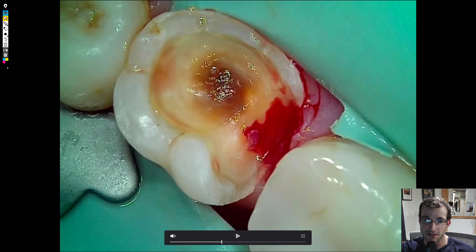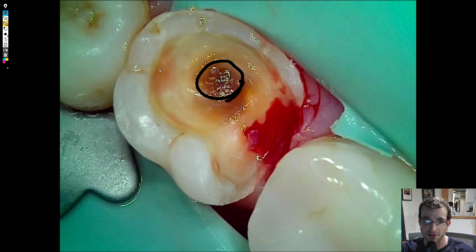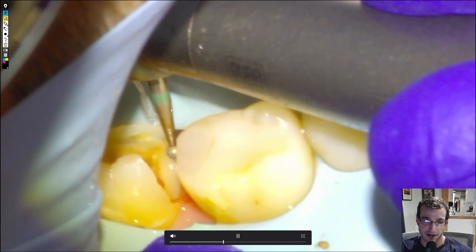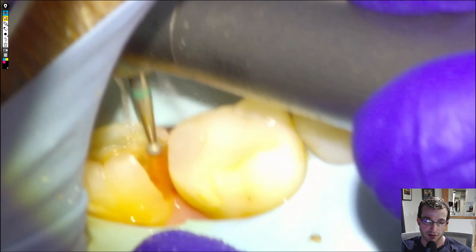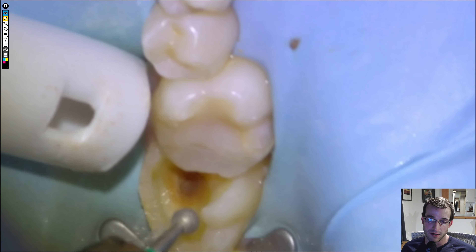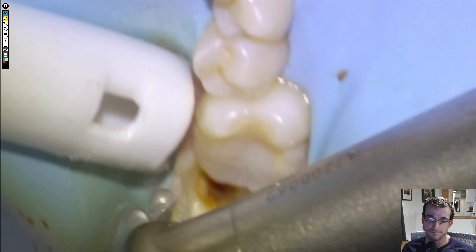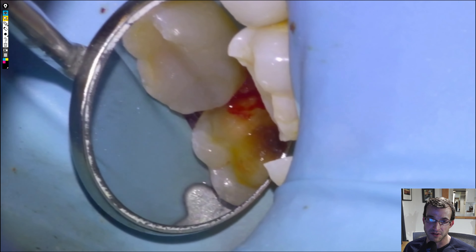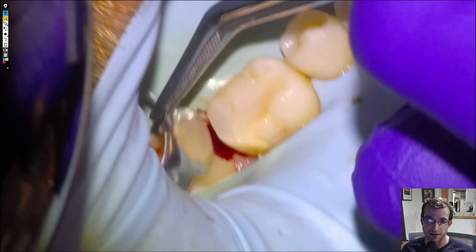Especially around the DEJ, we're fine leaving this bit of decay right in the middle because we have a clean rim. Still a little ways to go here and there, but that's what I like to do to prevent drilling into the pulp. For the last bur, I always like to use a large round so that the internal surfaces of the prep are nice and smooth and round so that the material adapts well. I find that Equia Forte is prone to trapping bubbles, so it's important to have the right technique.